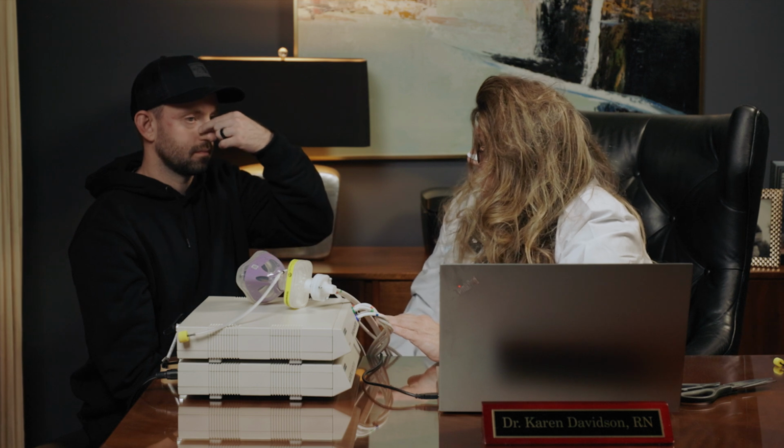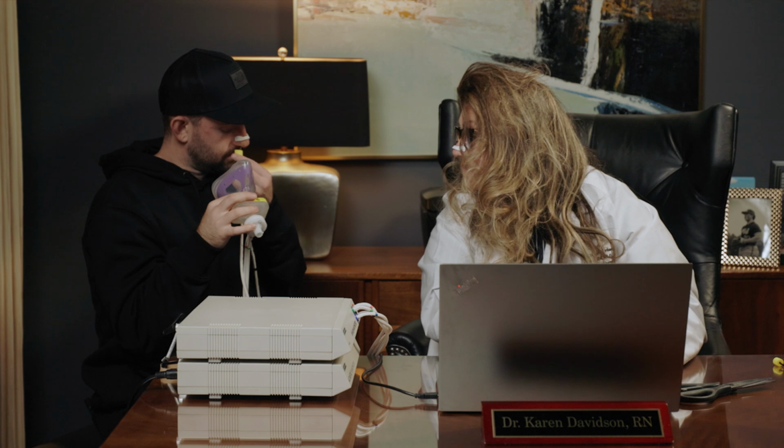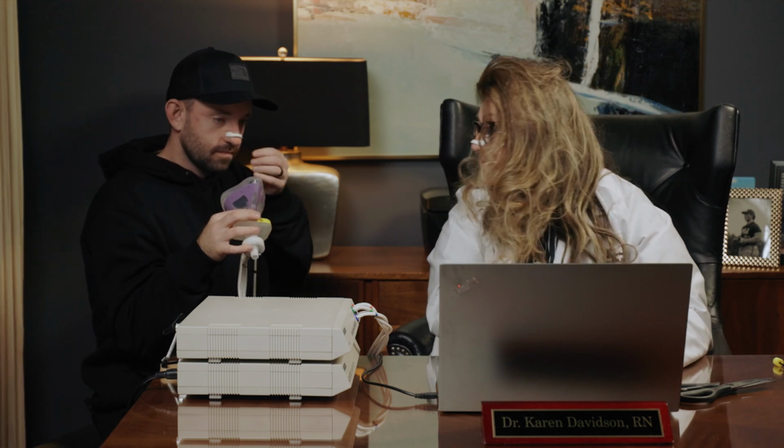We're going to do a rhinomanometry test with the Intake band to see if the breathing can improve and the resistance can drop. So we're going to repeat what we do. Alrighty, that's our baseline. I'm going to go up here and start a new test. Are you ready? Make sure you have a good seal. Sit up straight. Beautiful. All right, we're going to switch over to the left. Do you need a new foam? Is it still good? Up straight. We don't want any compensation.